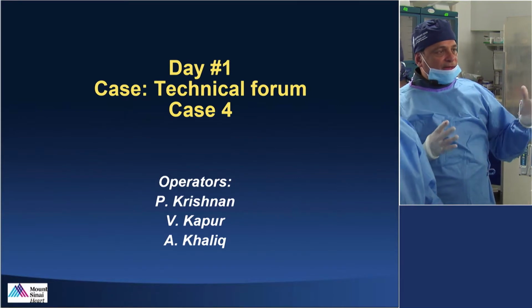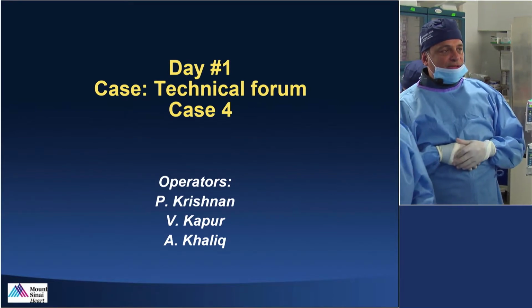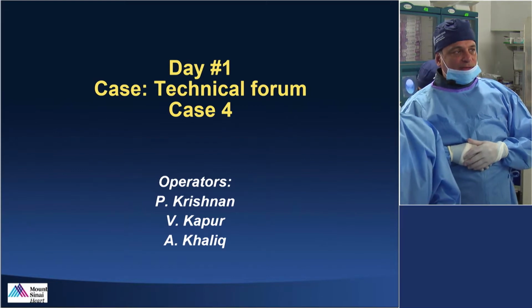But we want to show something a little similar, yet show some different technology here and how we can handle a similar type of lesion.